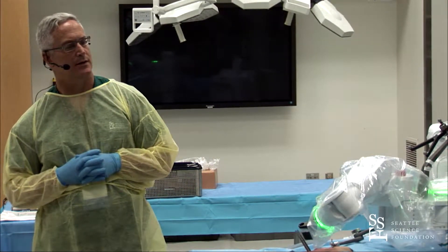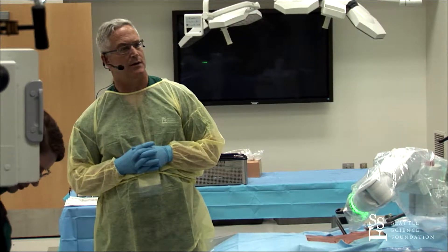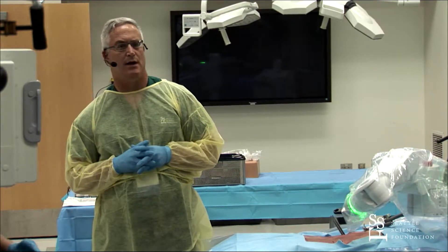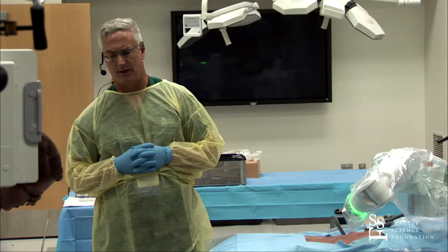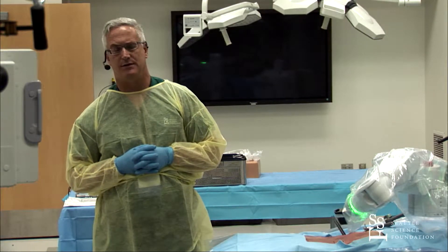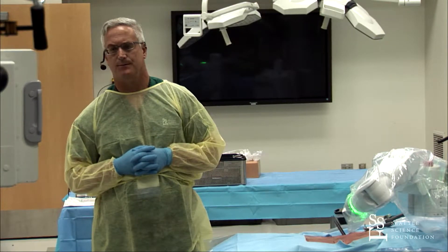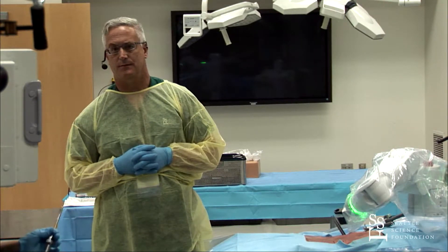If you're doing a case like this — a spondylolisthesis at L5-S1 — and the trajectories are far lateral to medial, do you do them all with a single stab incision? And then if you have decompression work and a T-lift, you go to a midline incision? Actually, if you could accomplish a reduction and decompression using stab wounds unilaterally and then connecting those incisions on the contralateral side, that's been successful for me with the interbody and reconstituting the disc height. You can get some reduction across the rods as well. So you connect the dots between your right and left incisions — or the ones above and below — and you're not doing anything in the midline at all.